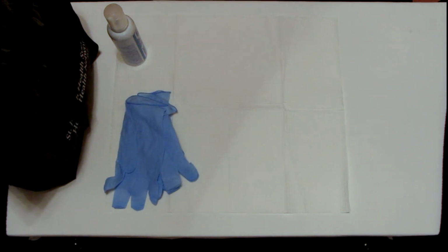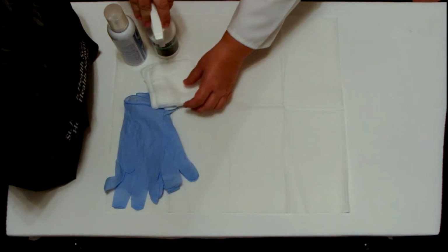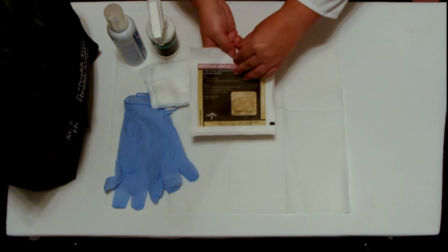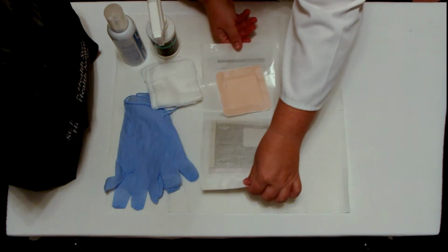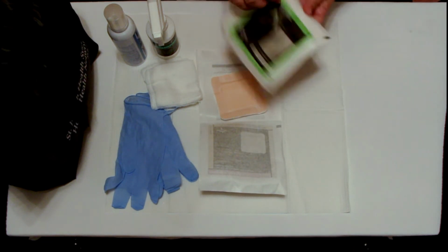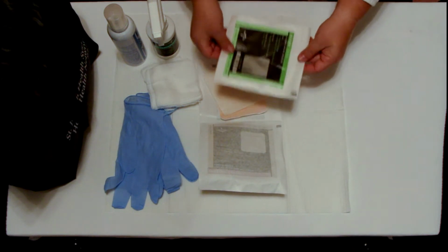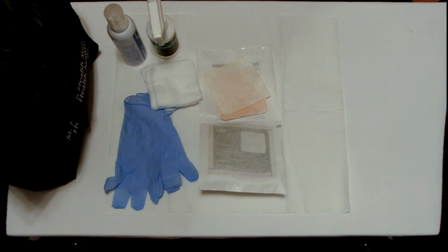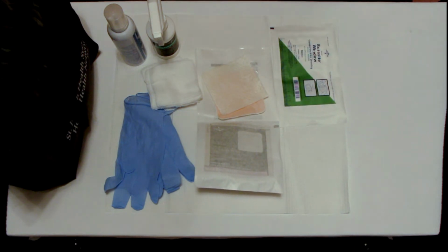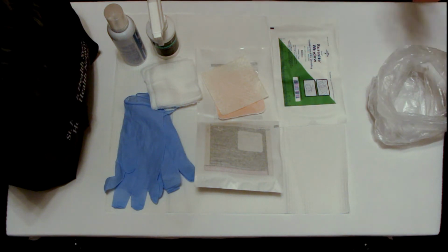gloves, wound care cleanser and 4x4 gauze, Optifoam secondary dressing, Max Zorb Extra Alginate wound dressing, the optional transparent dressing, and a small trash receptacle.